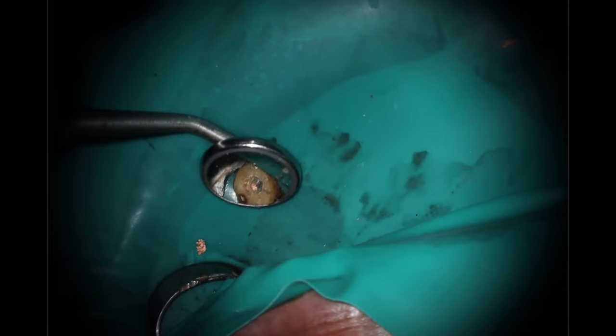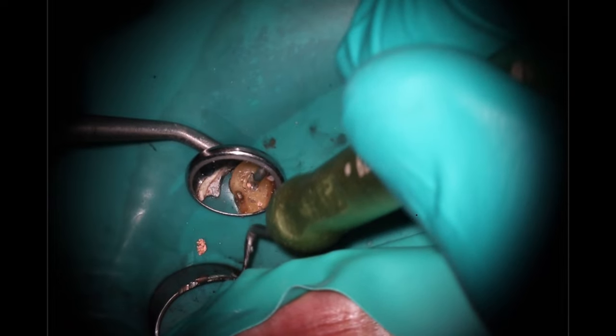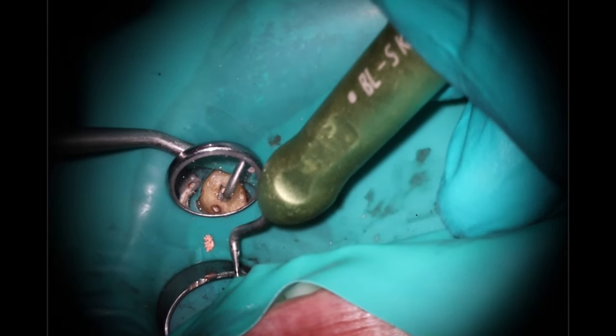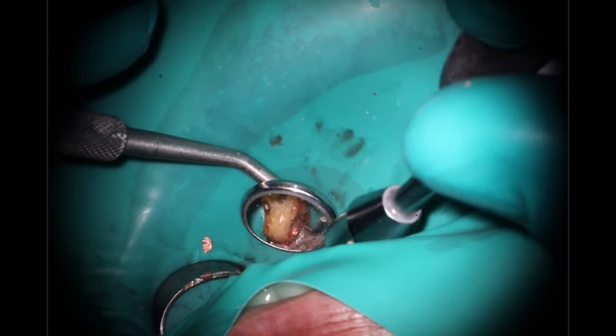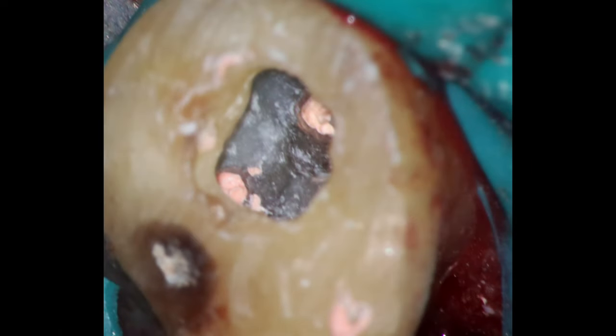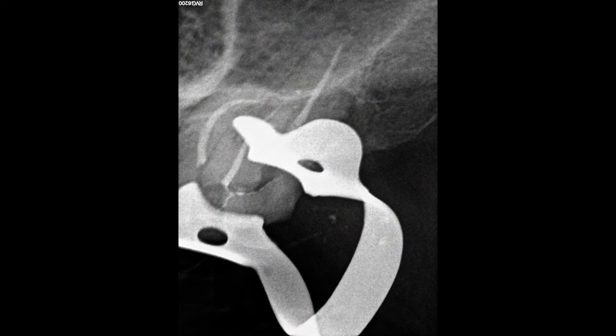In this case, getting the check film was a mess. Her tooth is angled, she has a really shallow palate, and it's twisted — so it took multiple x-rays. None of them look great. However, between a couple of them, I was able to see that everything looked good. I'll show you in a second the best looking one out of all of them. I also did take a quick check film of the palatal, making sure that my gutta-percha cone was to length. This was such a strange case — I didn't want to leave anything to chance. Generally if I'm at my working length, I don't worry about it.